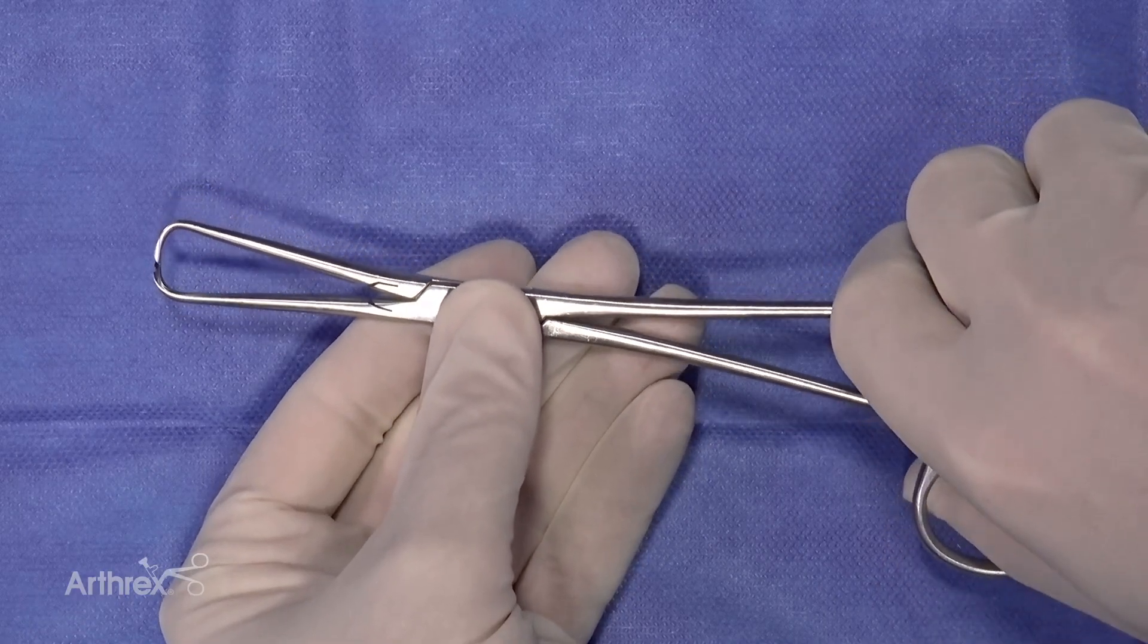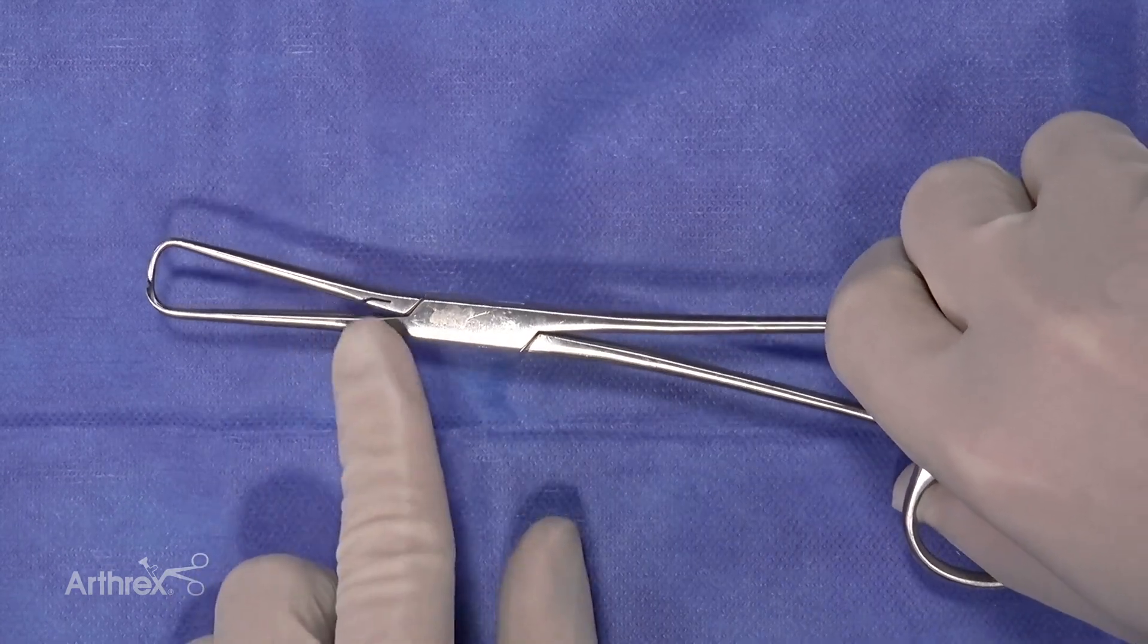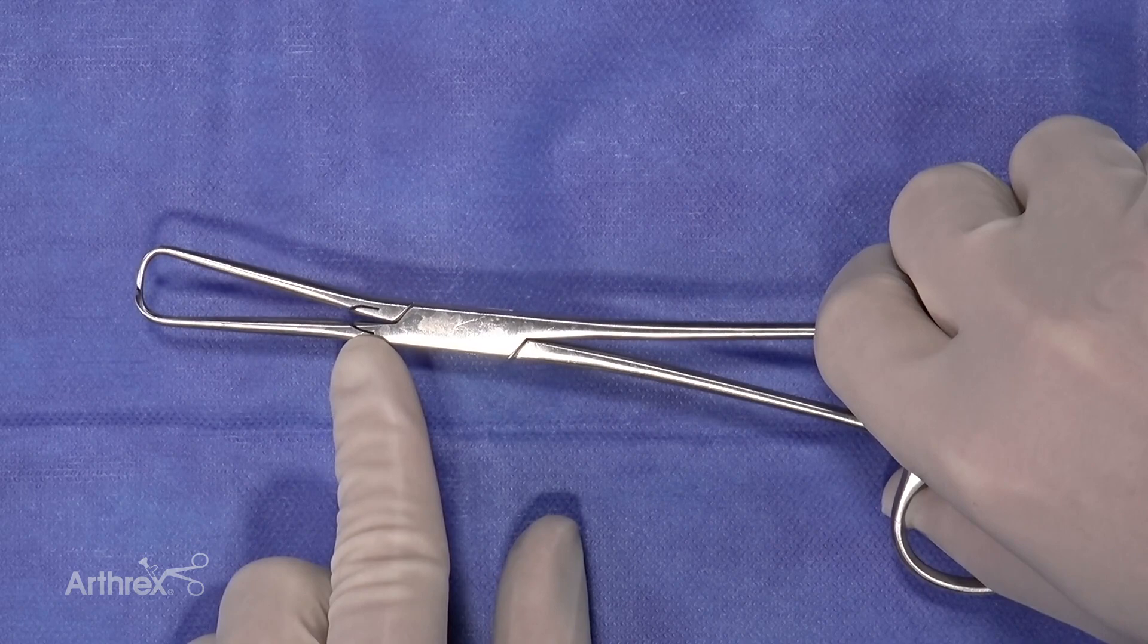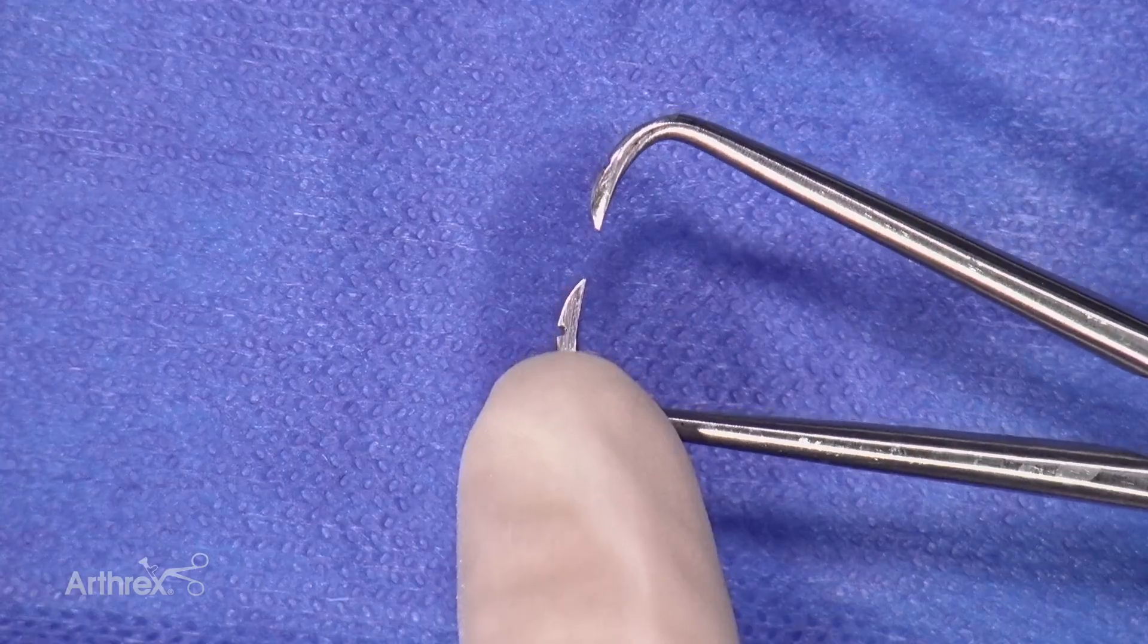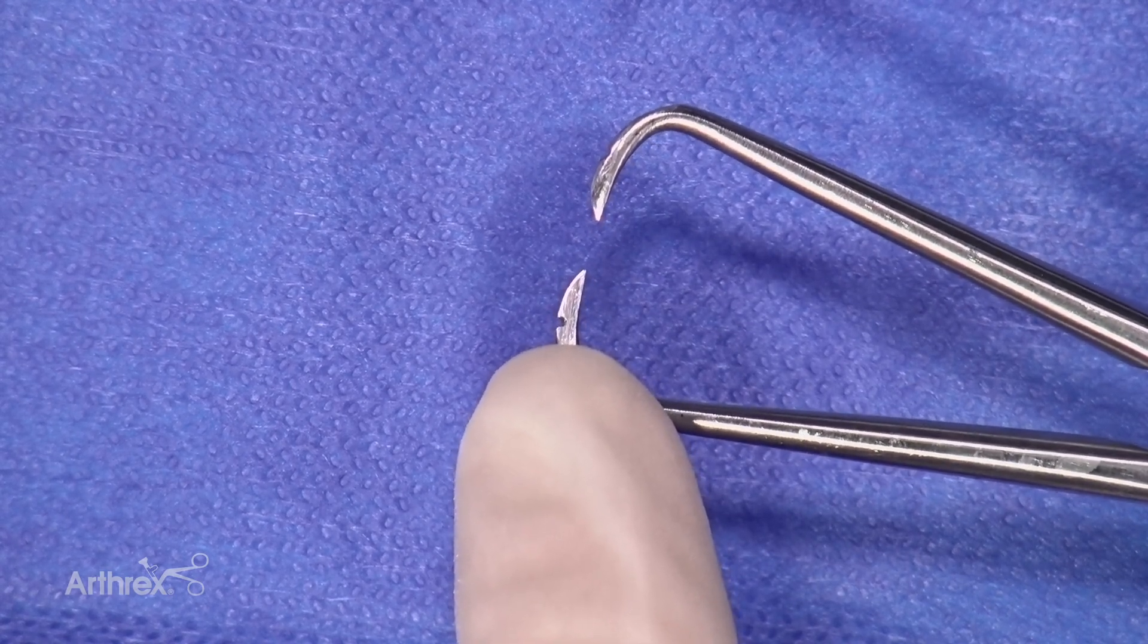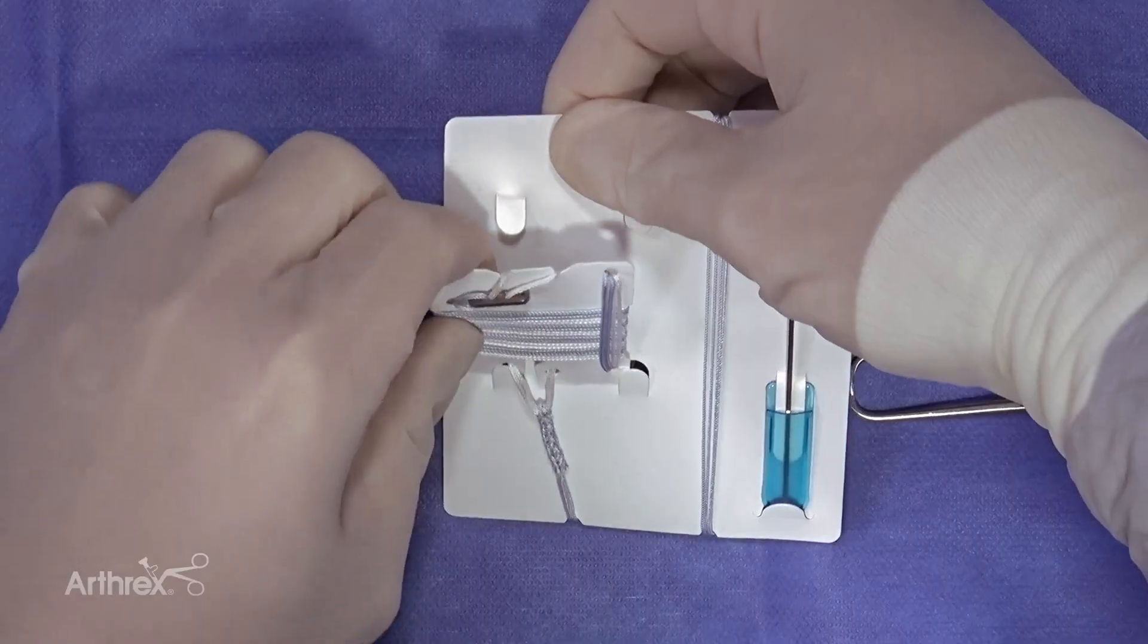These slots are used to hold the cord and the fiber tag while we're applying it to the graft. This is a notch which will help hold the fiber tag, making this very easy. It comes in a nice package we can easily unwrap and it's self-contained.